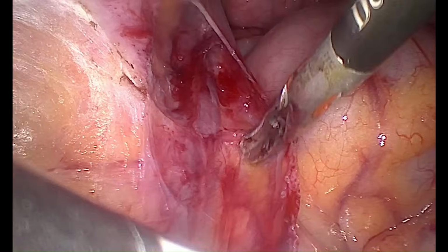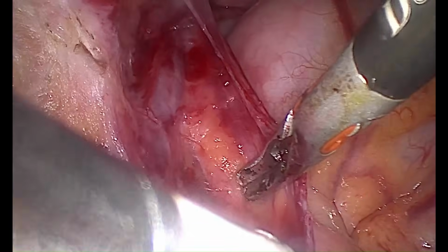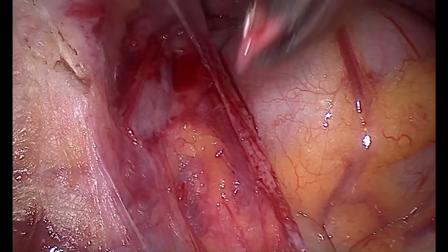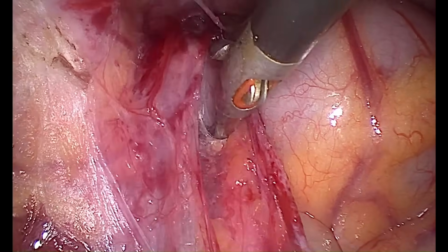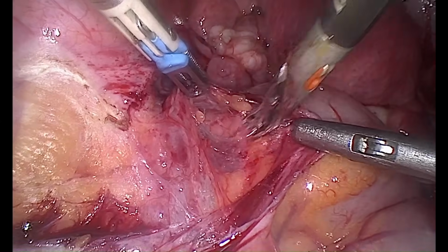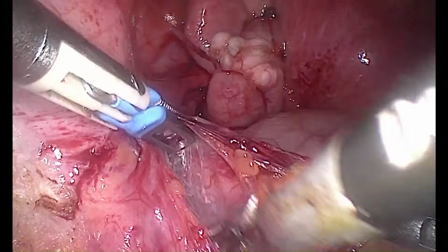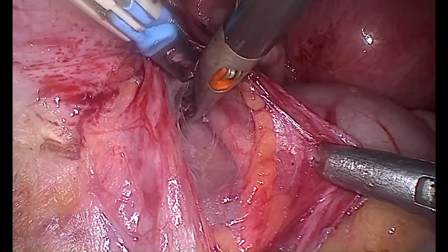The ureter has its own sheath, called the ureteric sheath, and if you do parallel movements you can get the ureter under vision. You can see I am cutting the ureteric sheath and the ureter is going to get visualized. This is the popular technique, wherein you should always be parallel to the tubular structures. If you are parallel to the tubular structures, usually bleeding won't occur.